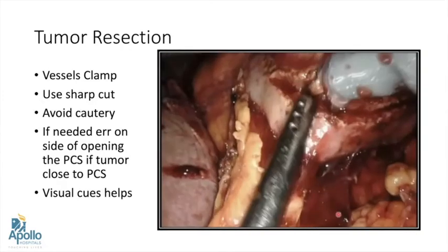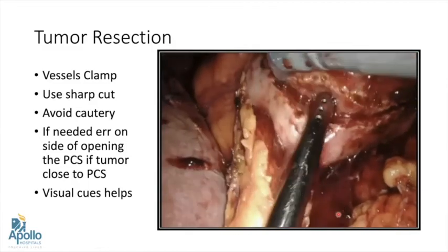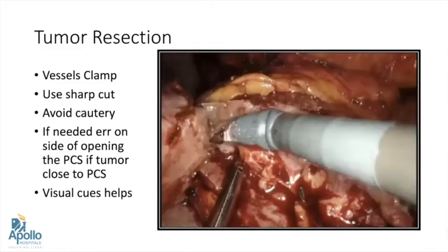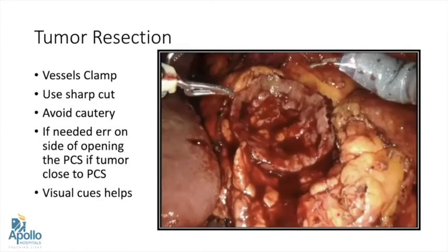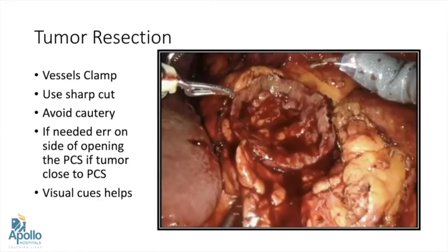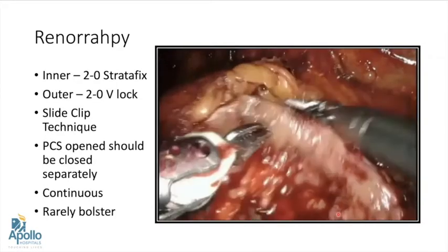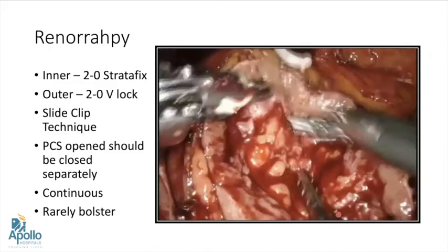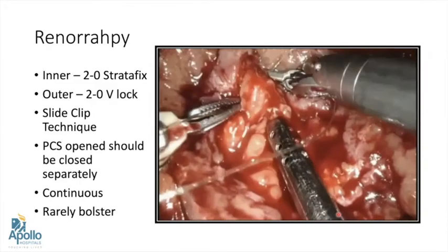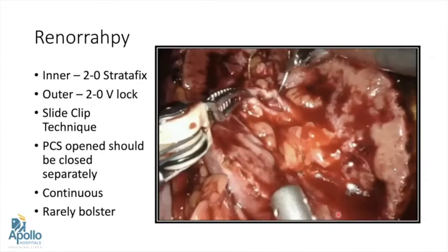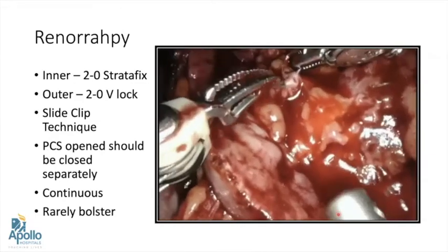Once demarcation is done, the next step is tumor resection. Vessels should be clamped depending on complexity — either artery alone or both. Sharp cuts should be used and the tumor resected all around. We should avoid using cautery if possible. If the tumor is close to the PCS, we should be ready to open the collecting system. Visual cues are very helpful during partial nephrectomy.